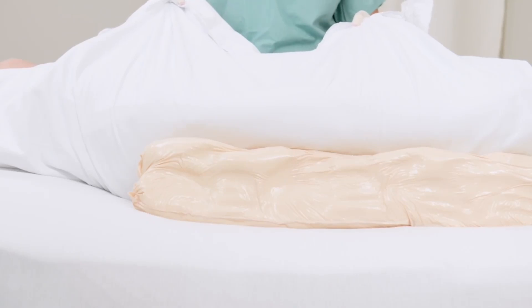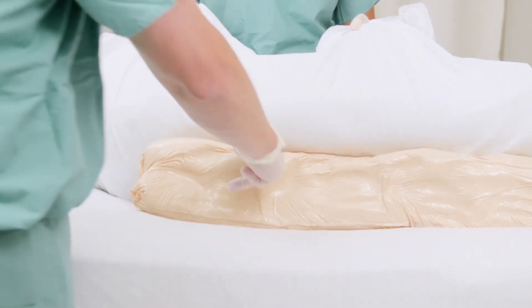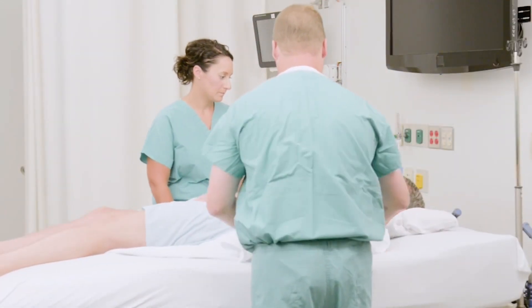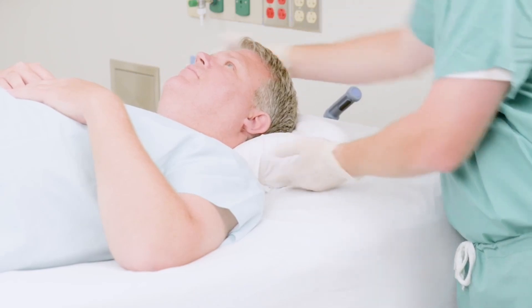The fluidized positioner lets the clinician dictate the degree of turn, ranging from a small micro turn all the way up to large degree turns. If needed, you can hollow out areas for medical lines, tubes, or existing wounds. Tightly tuck the draw sheet under the positioner and patient to secure the positioner in place. Adjust the positioner under the head to keep the body in alignment.